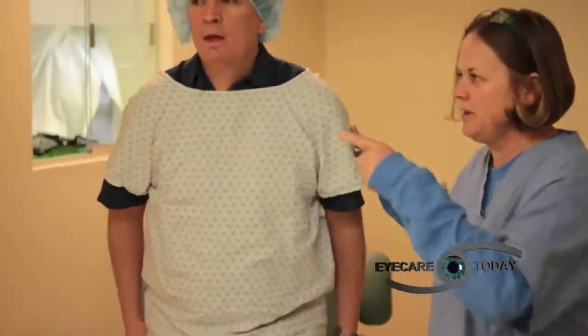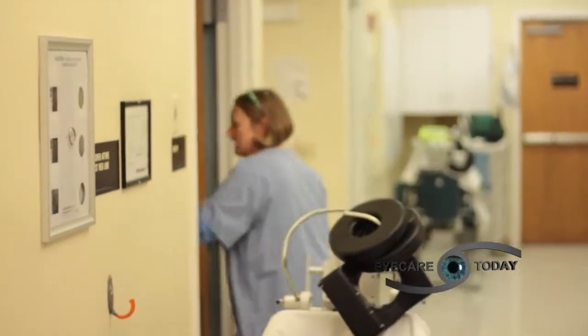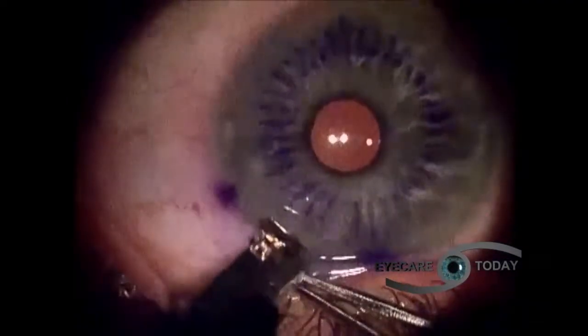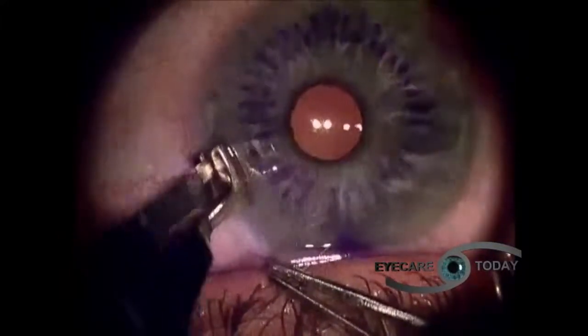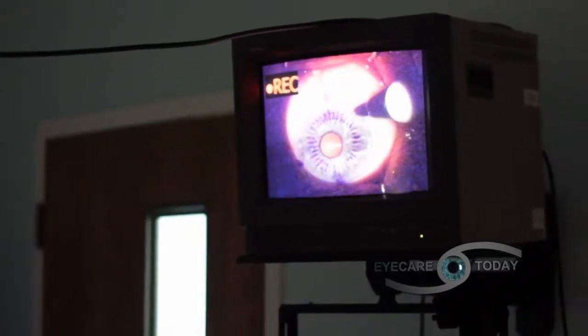After some prepping in the examining room and operating room, I was ready to go. They're going to cut my cornea apparently to reshape my eye so it fixes my astigmatism. A few minutes later, Dr. Bucci went to work. Okay, look at the two light streams. Incisions are made outside of the optical center of the cornea, causing it to relax and become more spherical or round like a basketball. A spherical cornea allows light rays to focus at one point on the retina, resulting in a clearer image. It means the blurriness goes away.